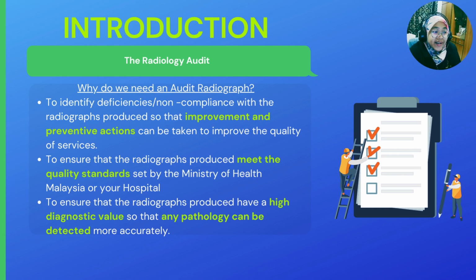Firstly, to identify deficiencies or non-compliance with the radiographs produced so that improvement and preventive actions can be taken to improve the quality of services. Secondly, to ensure that the radiograph produced meet the quality standards set by the Ministry of Health Malaysia or your hospital itself.